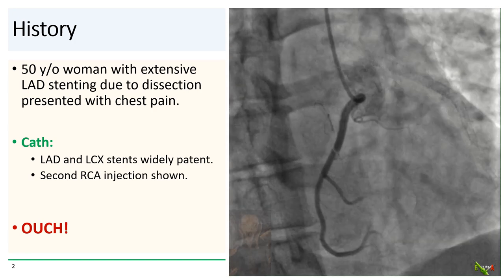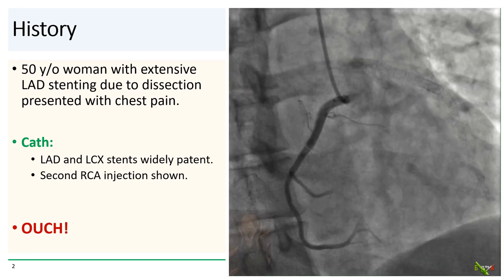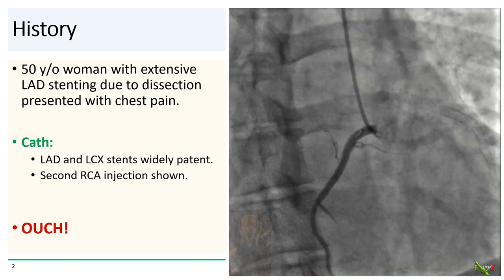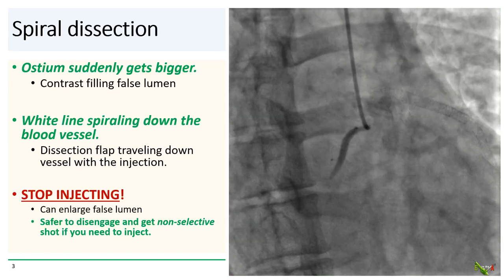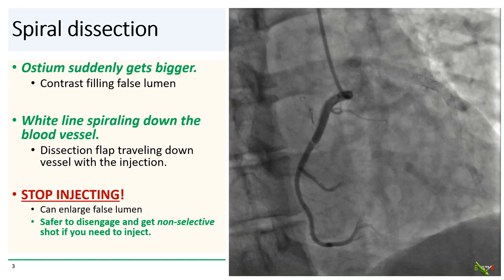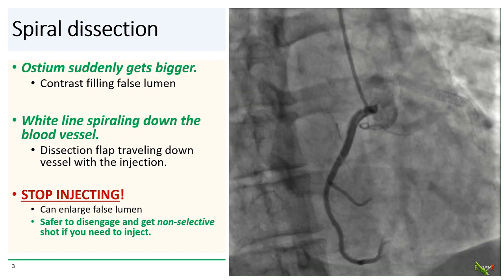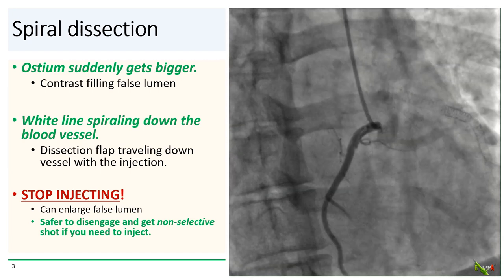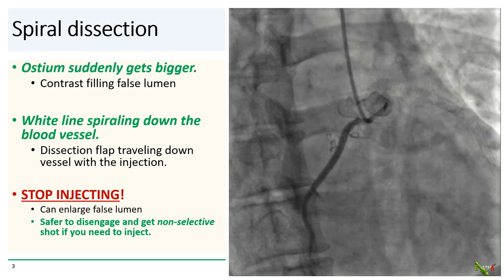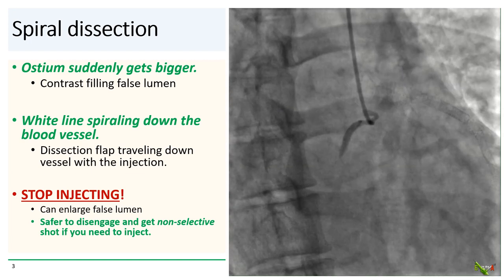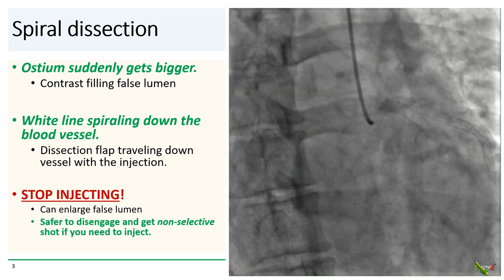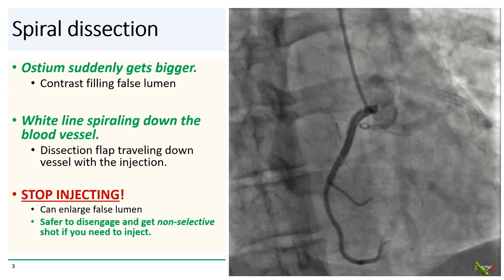We see the RAO injection of the RCA here. Now look at the angio carefully — you almost get a visceral reaction looking at it. What we see is a spiral dissection of the RCA from its ostium down, caught on cine. You see several striking features: the ostium suddenly gets bigger from the contrast now filling the false lumen. You see the white line that spirals down the blood vessel — that's the dissection flap traveling down the vessel with the contrast injection.